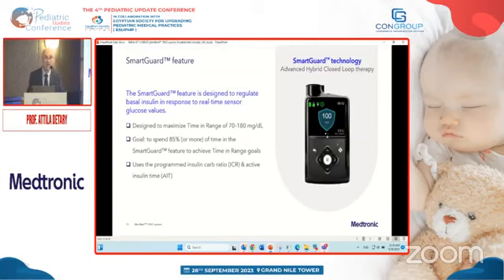At first sight on the pump, you do not see the graph, you see a shield, as you can see on the image on this slide. That shows you the current glucose value, getting updated every 5 minutes. And there can be arrows showing the trend up or down. And if you press a button, you can switch into the graph. I will show you later.